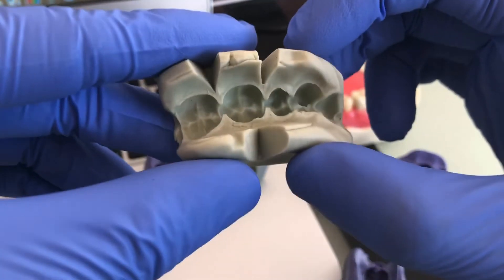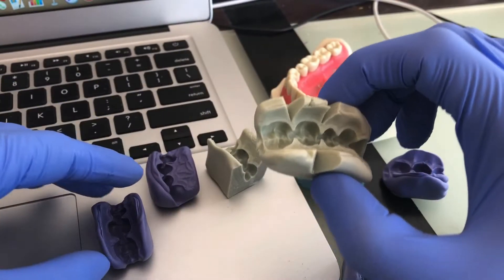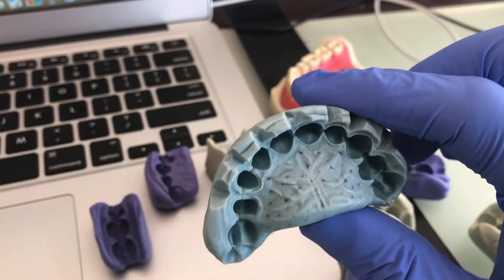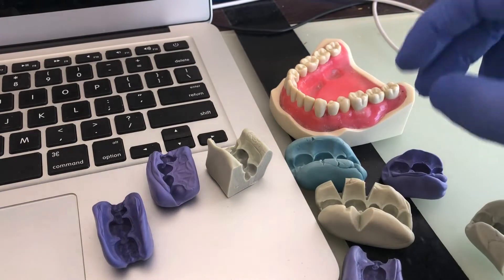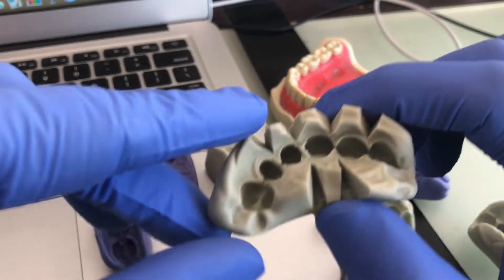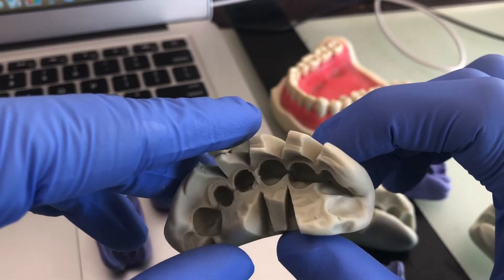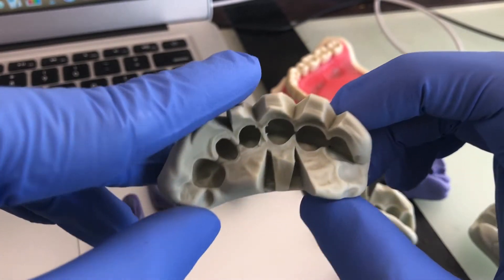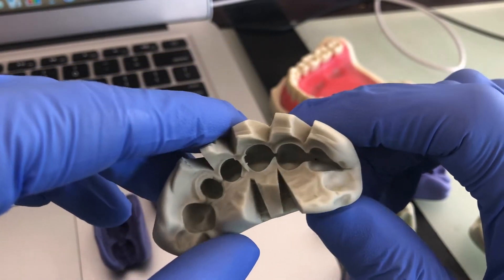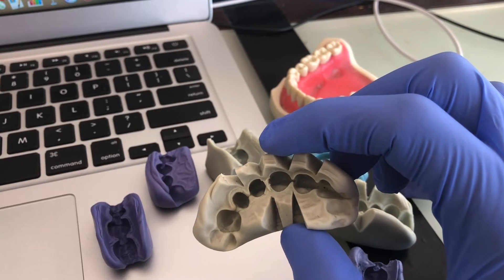For a provisional crown, you need a really nice putty if you want it done in less than 10 minutes. For crown prep, it's a good guide — but I always tell people, don't rely completely on the putty. After a while you can just look at a crown prep and tell how much reduction there is. However, especially with occlusals on molars or front teeth, it can be tricky, so it's best to have a guide.